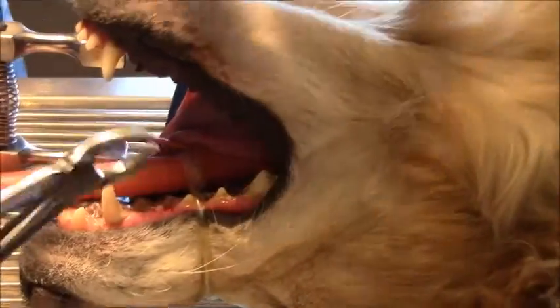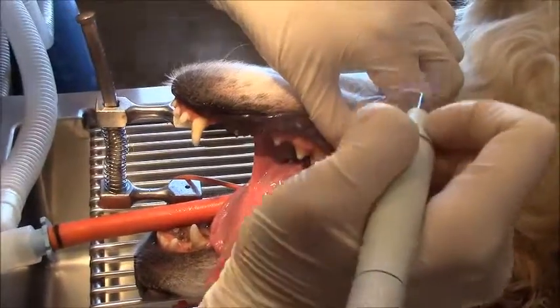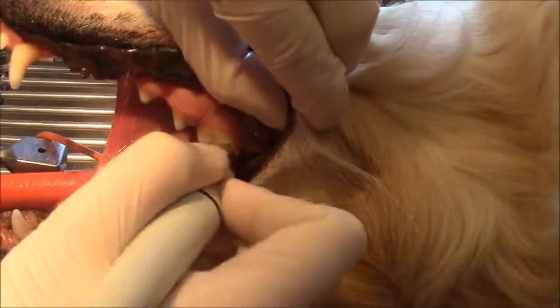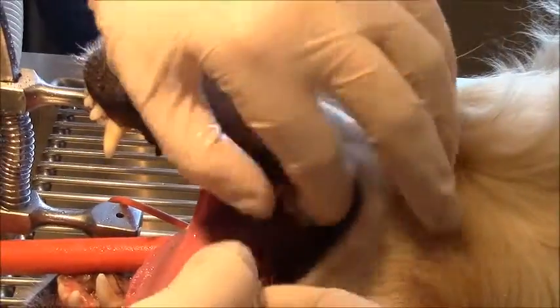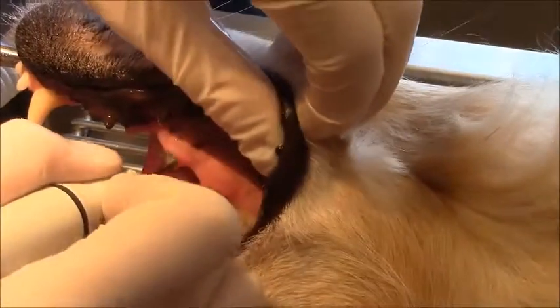Like I said before, I'm going to start with the scaler — I'll just show you a little bit. We take the base of the tooth; as you see, it can remove quite a bit of buildup. So now I'm starting to scale the mouth with the scaling instrument. As you see, it's releasing a small amount of water onto the tooth to cool it off. The most important part is not to keep your instrument on the tooth for too long — even though water is releasing onto it, it's important never to leave it on for more than about five seconds. I'll rotate between each tooth and always come back to some of them.